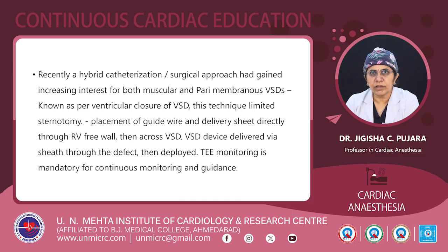Recently, a hybrid catheterization and surgical approach has gained much interest for both muscular and perimembranous VSDs, known as perventricular device closure of the VSD. In this technique, a limited sternotomy is done, with placement of the guide wire and delivery sheath directly through the RV free wall and then across the VSD.